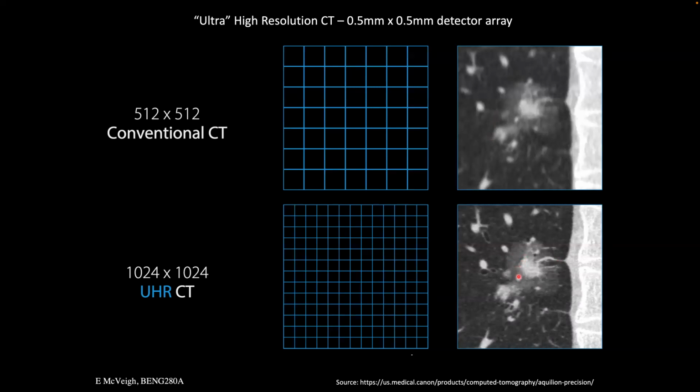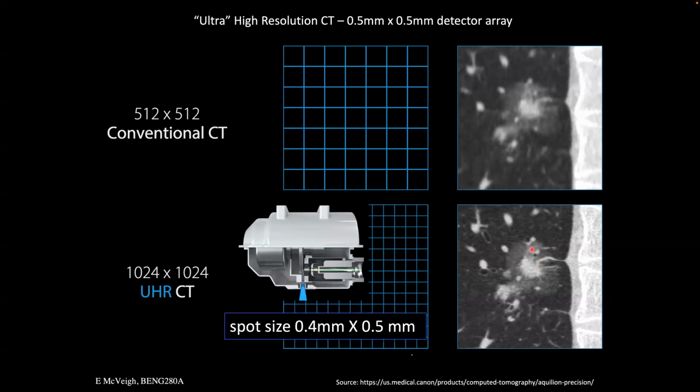And the border of this bright zone plus the texture of the tissue itself, it looks like a very smooth, constant texture, as opposed to something that had a rougher quality that you would not be able to detect up here. So, I think definitely there's remarkably new information here.